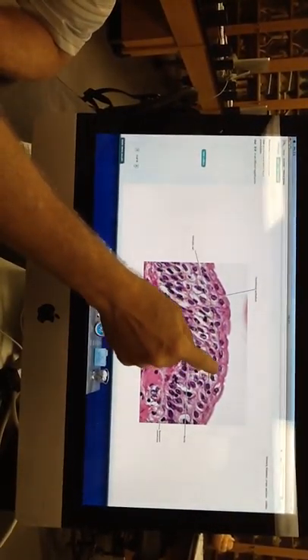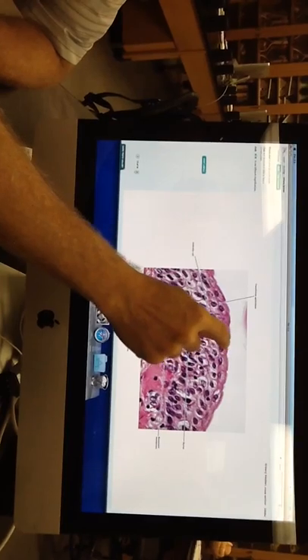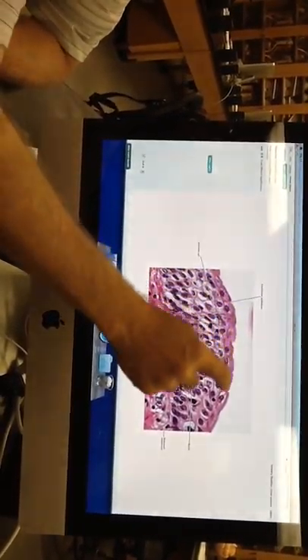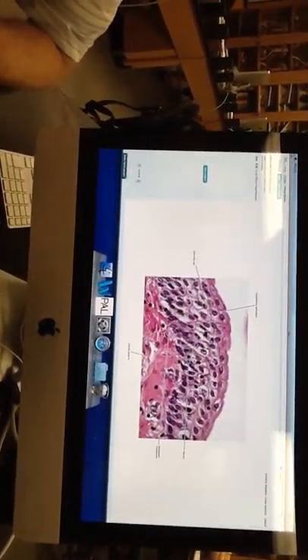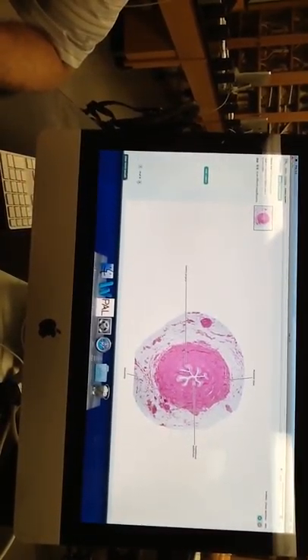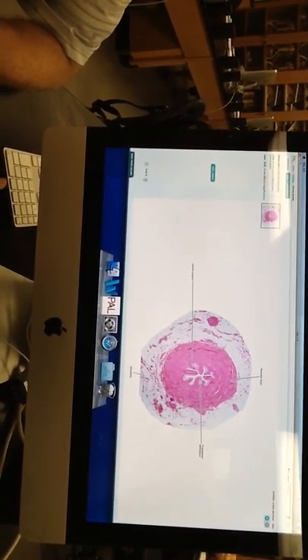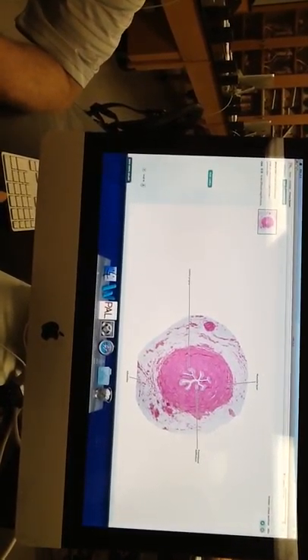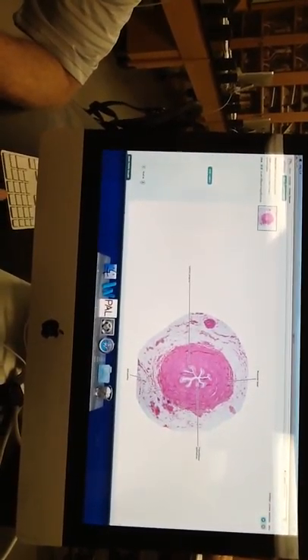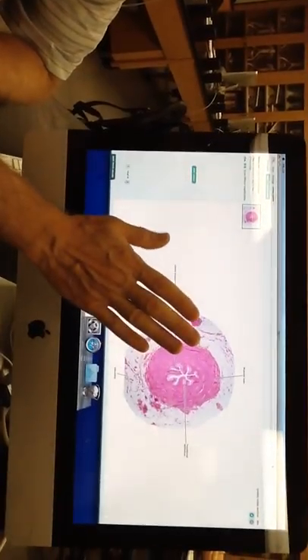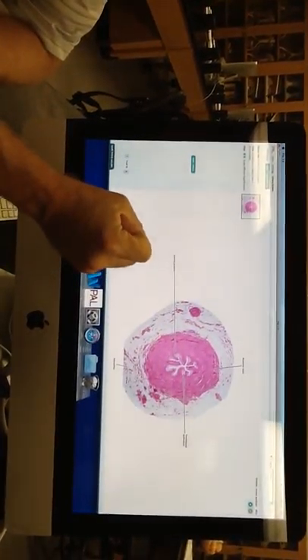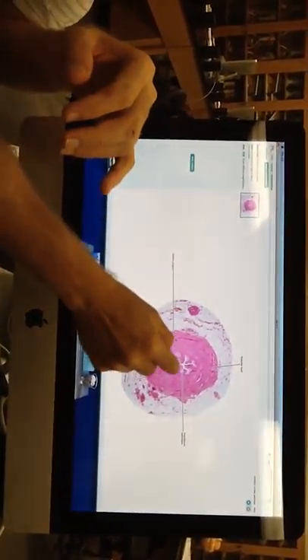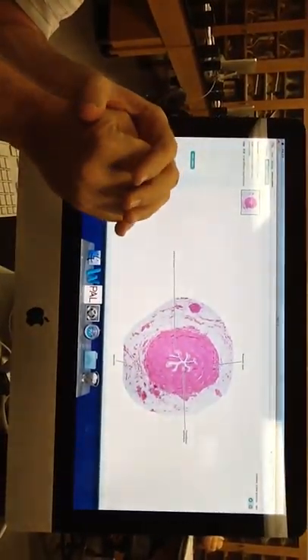And this is the same thing, just a different kind of stain. I don't know. It doesn't even look like that great a slide to me. There you can see those epithelial cells kind of laying on top of each other. The surface has these umbrella cells that have this sort of sealed epithelial layer on top of them. I don't think that's on your wish list, though.